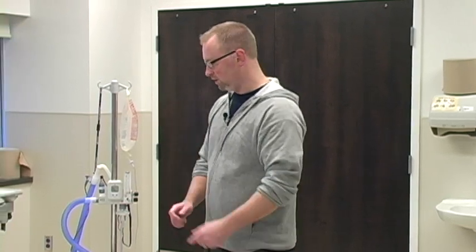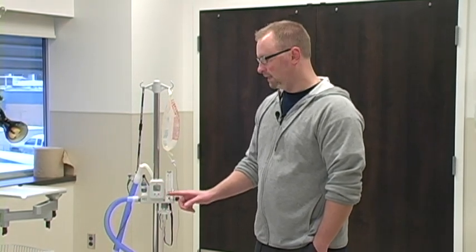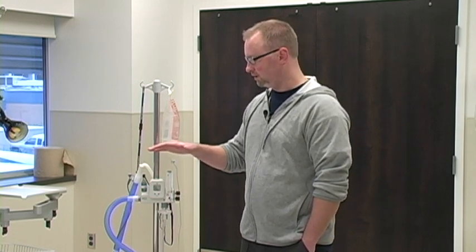The one thing I would like to mention though, I mentioned the flow meter and the oxygen analyzer earlier. They're a little bit finicky to set up with these two dials, they use something called a Venturi principle. So as you adjust one, the other one is affected. So once it's set up and the RT and everyone's happy with it, if the patient needs to get up and say go see physio and do a walk, or needs to go to the bathroom, or needs to go to CT, this is not available for transport. It's only at the bedside. So what you'll have to do is call the RT up to help get you ready for transport. You'll probably send the patient on a non-rebreather to wherever they need to go.